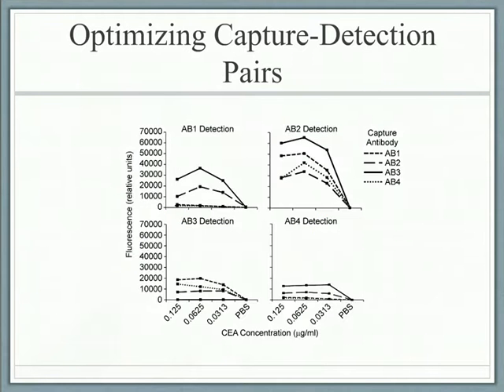And here's an example of an optimization for the analyte CEA, cancer marker CEA, with 4 different antibodies that were each used as the capture and detection. So each plot shows the curves with each of the antibodies as capture, and each plot is a different detection. So you see there are 16 combinations there. And what to note from here is that in each plot, the self-self pair doesn't work. These are all monoclonal antibodies, so they are against a specific epitope on the protein.